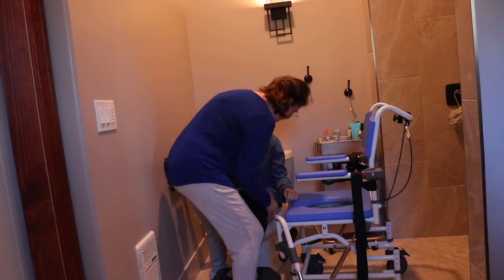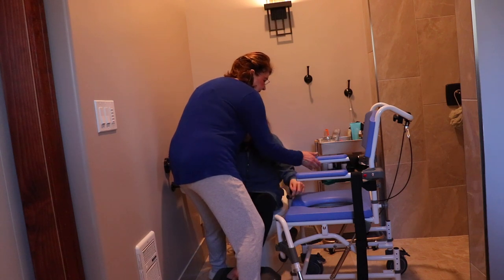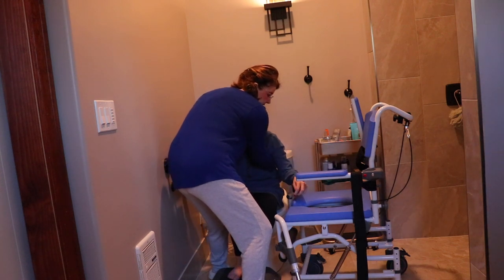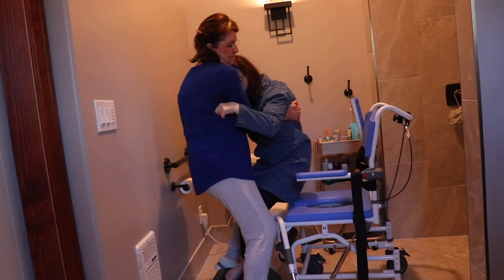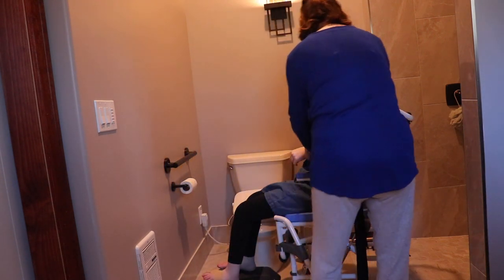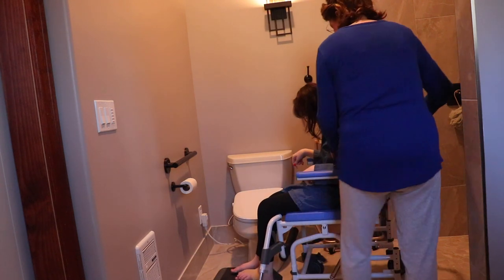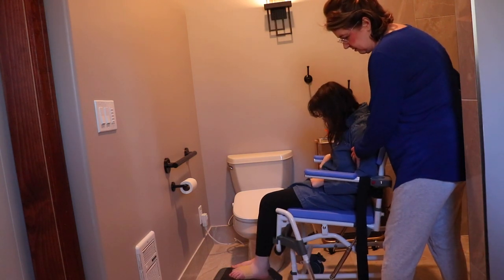This needs to be back a little more — there we go. Anna's going to count. Ready? Put that on to make it easier. Okay, ready — one, two, three. And then she's in the shower chair with her feet on the footrest so she has support. I adjust her — one two three — and then I can tilt it back if we need to use gravity.